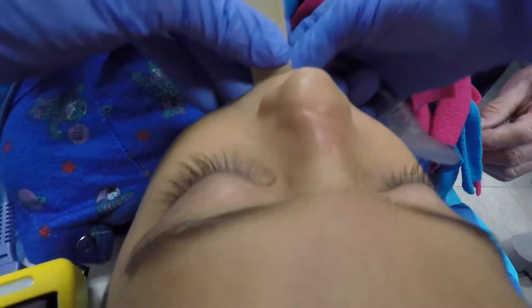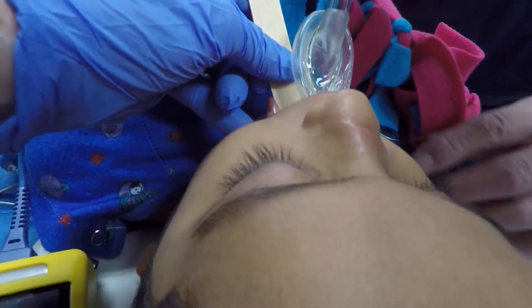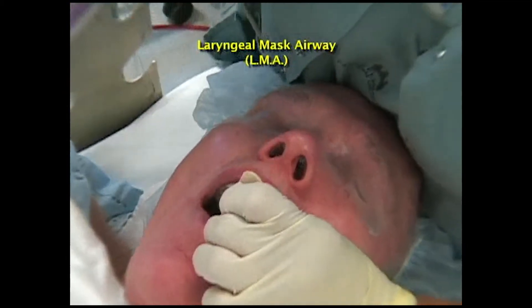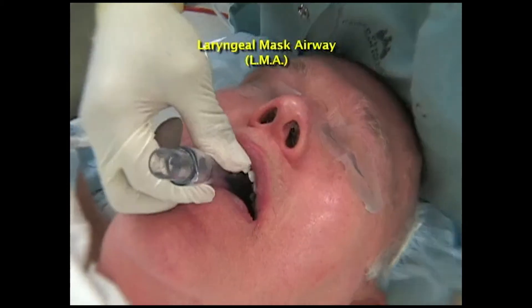Here is LMA insertion in a real patient. This is LMA placement in an adult, showing how you must place pressure against the palate as you slide the LMA into position behind the tongue.